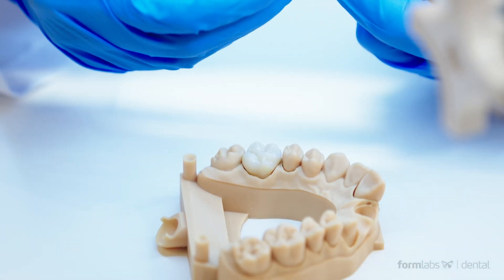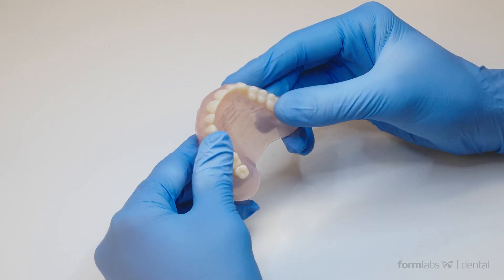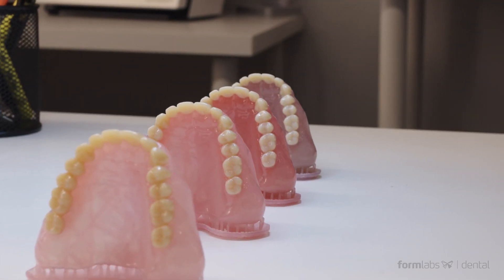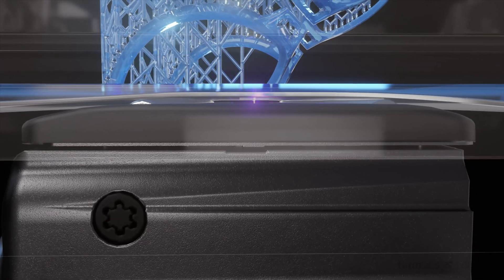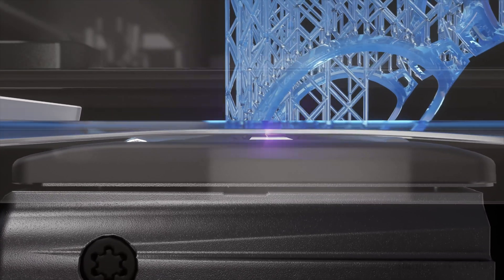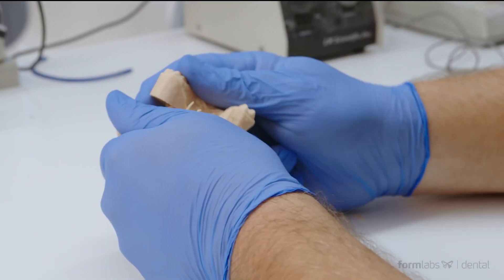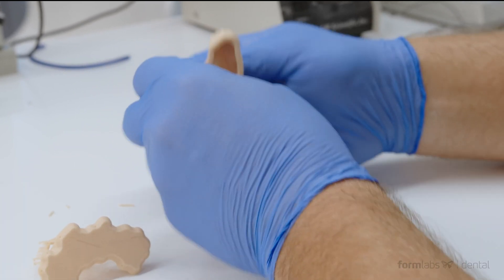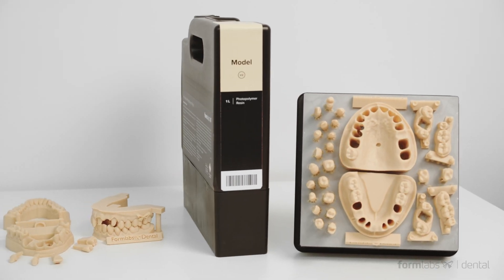All the state-of-the-art technologies we added to the Form 3B were created to help you manufacture parts you can be proud to deliver to your clients. Our proprietary industry-first low-force stereolithography technology reduces the strain created on a part when peeling it from the resin tank between layers, producing parts with incredible surface quality and clarity. Light touch supports make removing support structures easy and leaves virtually no marks on the parts' surfaces, delivering parts that are more accurate than ever.